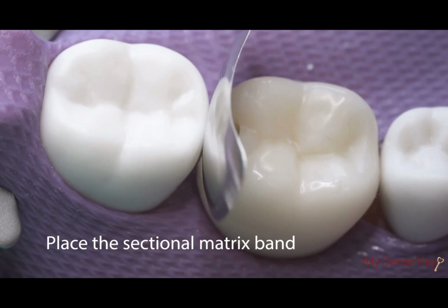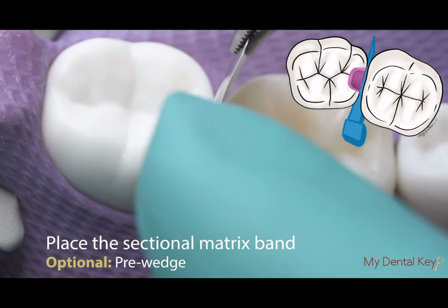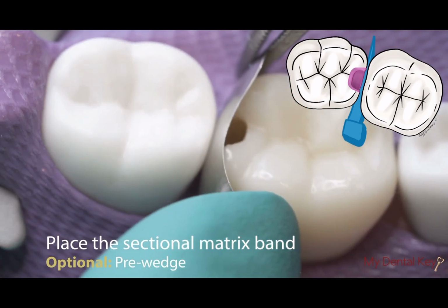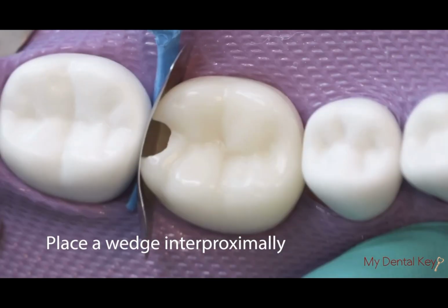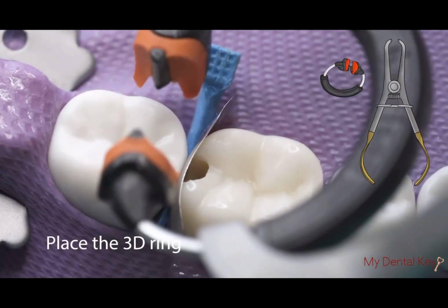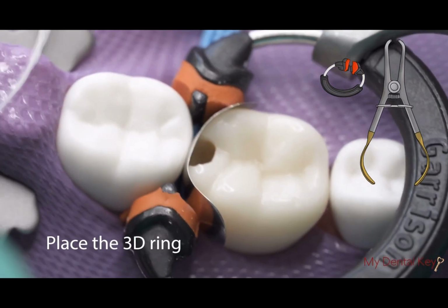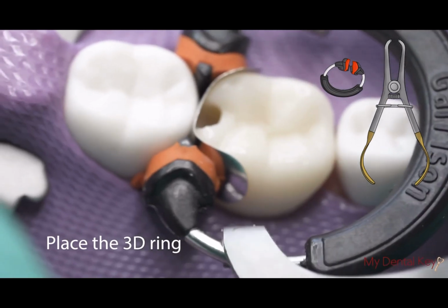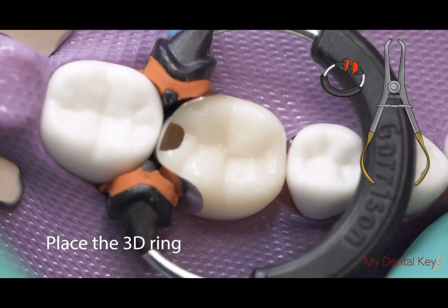Using your forceps, place the sectional matrix band interproximally. Optionally, to facilitate band placement, place an interproximal wedge prior to placing the sectional matrix band. After placing the band, place a wedge, either wooden or plastic, interproximally from lingual to buccal. Use the 3D ring forceps to place the 3D ring. Doing so should stabilize and hold the sectional matrix band in place. Collectively, this setup will help create a marginal seal as well as appropriate contour of the restoration.